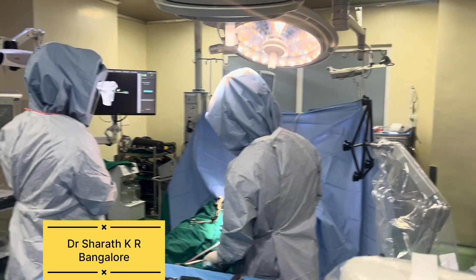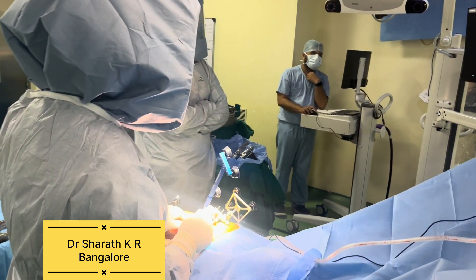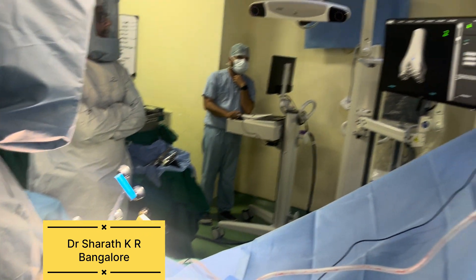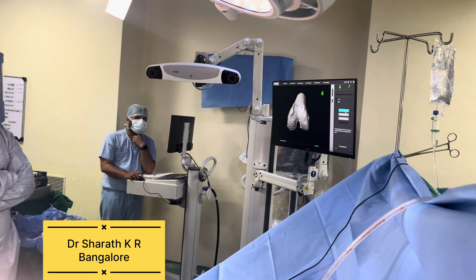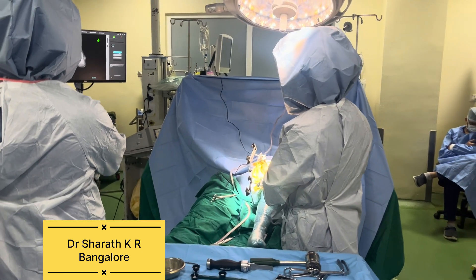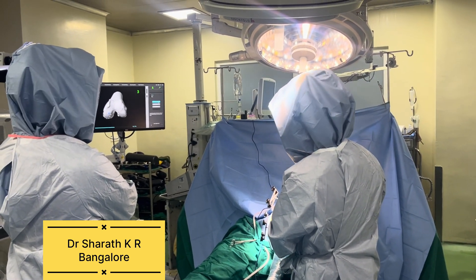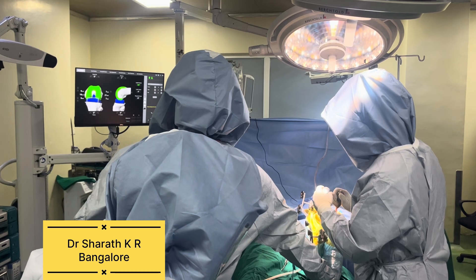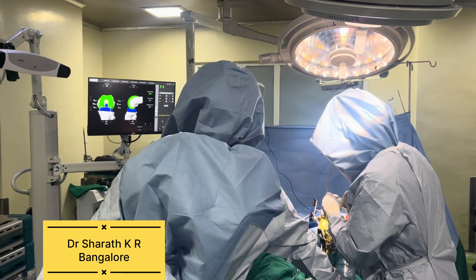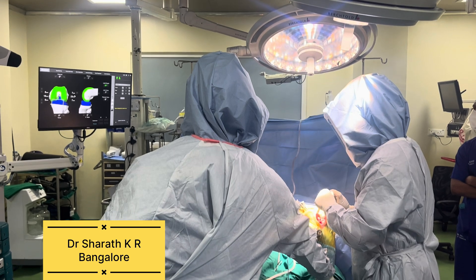This MAKO system is a CT-based system where the data of that particular patient we are operating on has already been uploaded on the monitor. We will be cross-checking with multiple points. This is called the registration process, meaning we register the parts of the knee joint of that particular patient on the CT image of the same patient which is already uploaded. After we do registration, there is something called gap measurement.